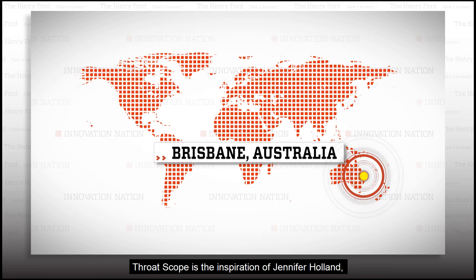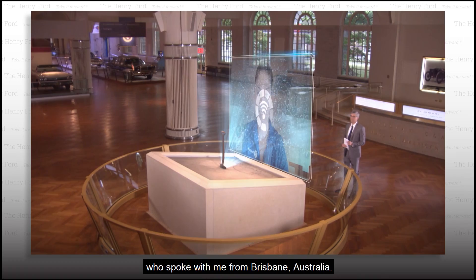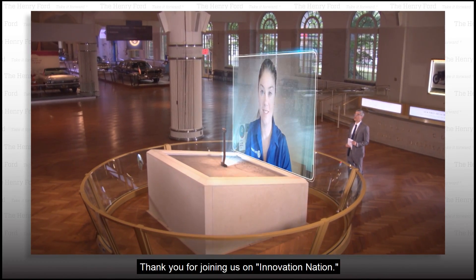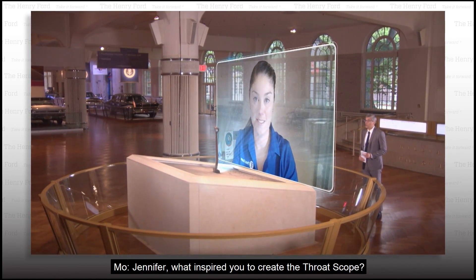Throat Scope is the inspiration of Jennifer Holland, who spoke with me from Brisbane, Australia. Hi Jennifer, thank you for joining us on Innovation Nation. Hi Mo, thanks for having me. Jennifer, what inspired you to create the Throat Scope?